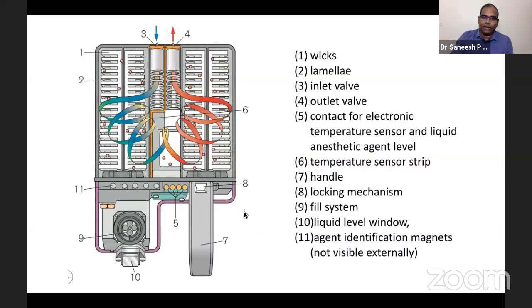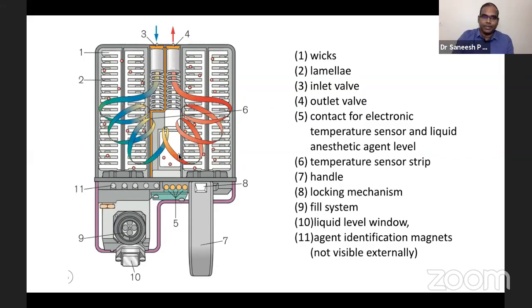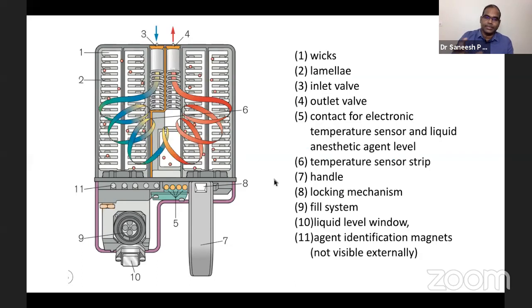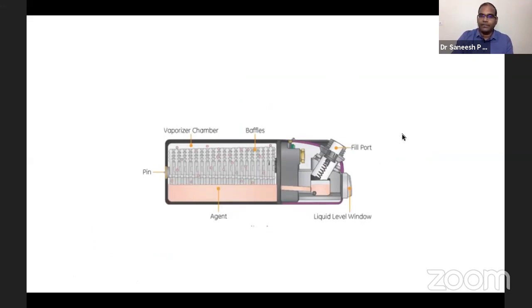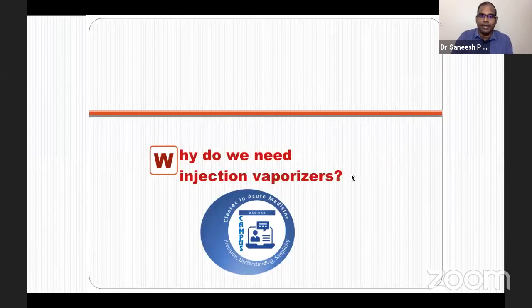So here, 8 is the lock. This will engage it into the machine. Okay, so through the inlet, the carrier gas comes, takes the vapor, is saturated and leaves the vaporizer. So all the corrective measures, sophisticated things are controlled by the CPU. How much is the dial concentration and all. Again, filling. You can see the filler. Again, it's a key fill system here for desflurane safety fill system. The liquid agent goes into this sump and then this is the vaporizing chamber with the baffles. It's clear, though it is sophisticated, in a nutshell or in real sense, it is simple. Only thing is precision is ensured by added things.